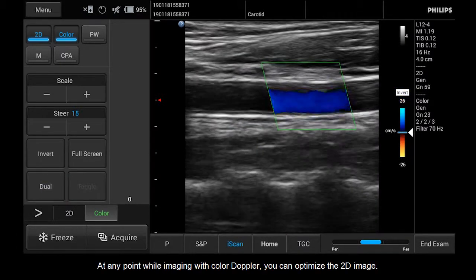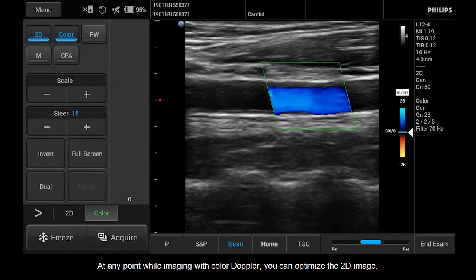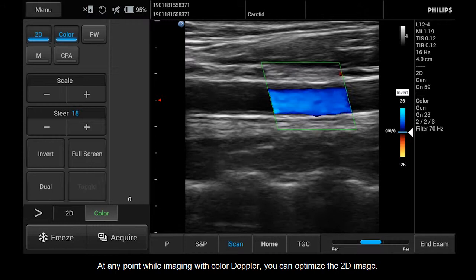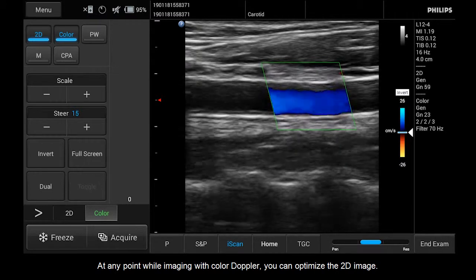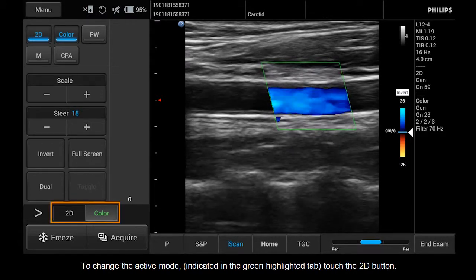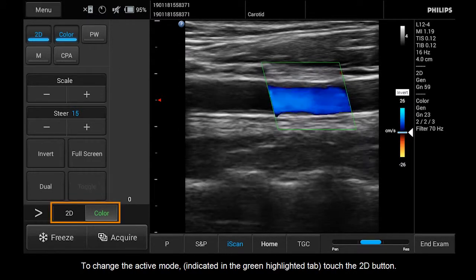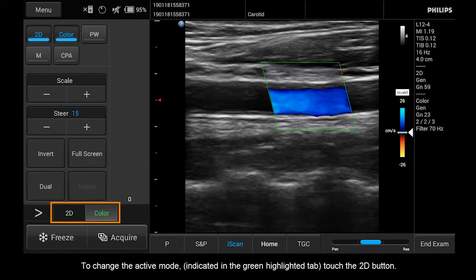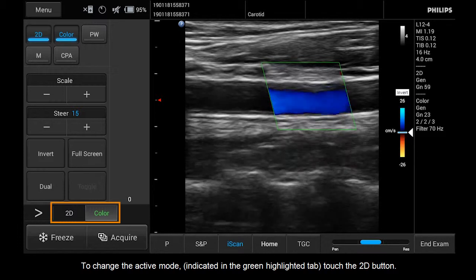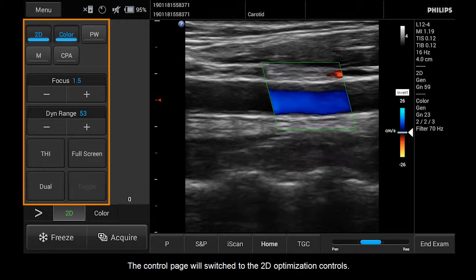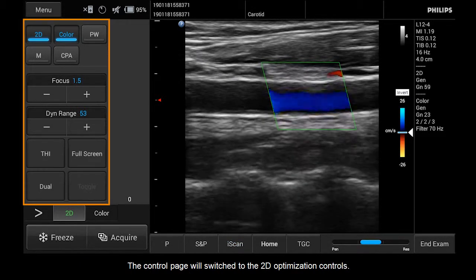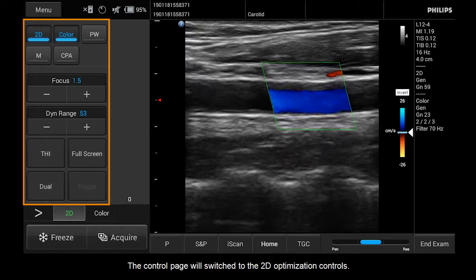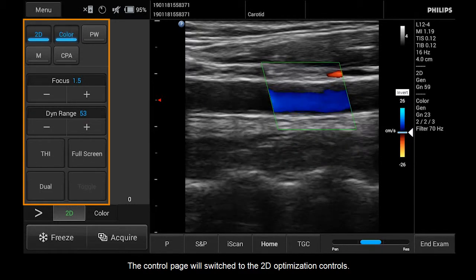At any point while imaging with Color Doppler, you can optimize the 2D image. To change the active mode, indicated by the green highlighted tab, touch the 2D button. The control page will be switched to the 2D optimization controls.